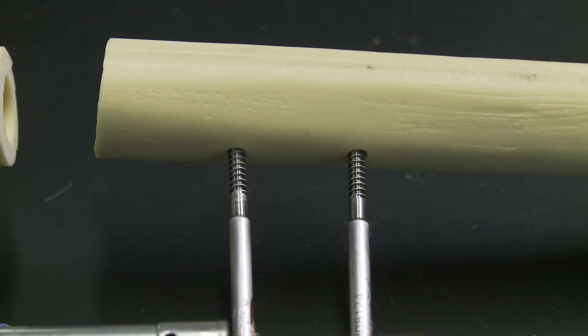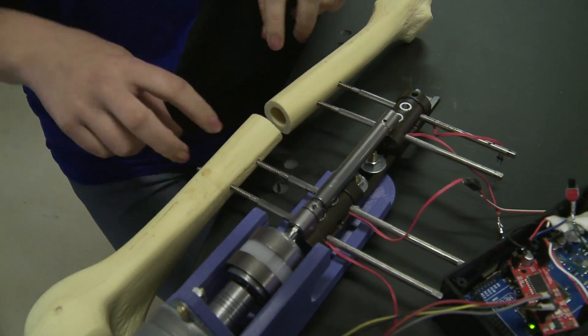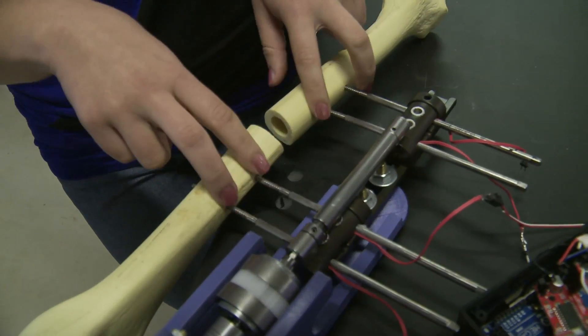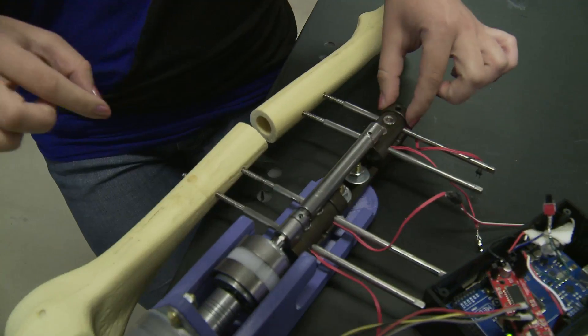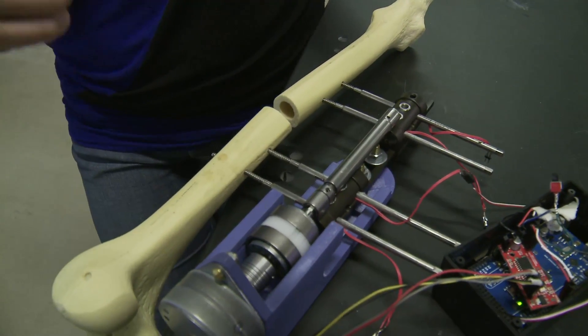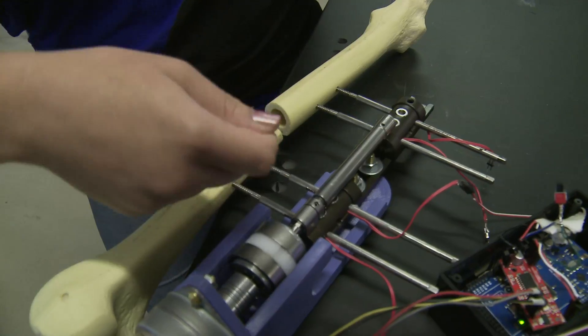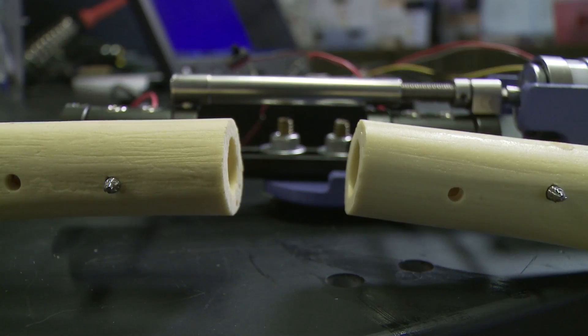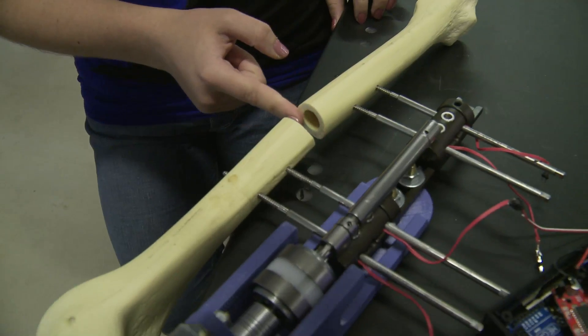So what they do now is they'll start with this bone, they'll drill these pins into the bone like you see here. They drill them in and then they'll put this frame and attach this part. That's what they have now and they'll use a wrench to turn this and that'll slowly separate these two pieces of the bone and the bone grows in between in this gap.